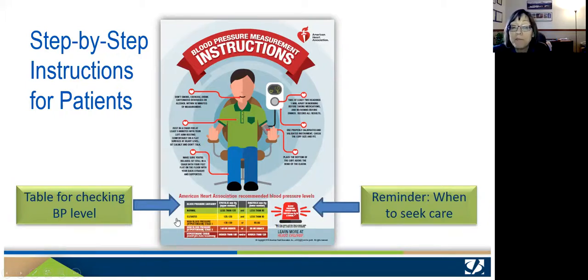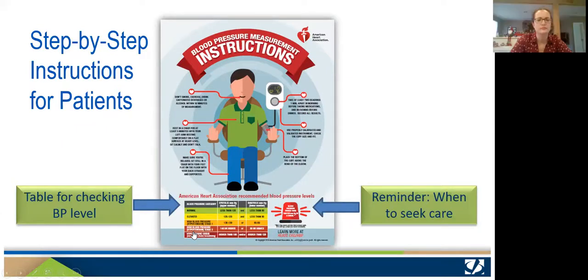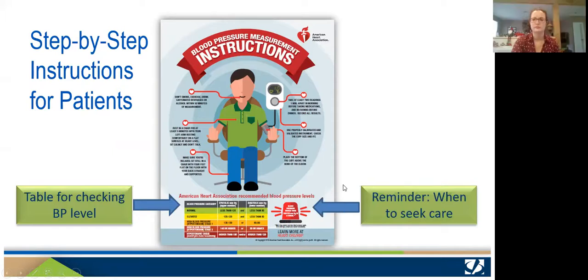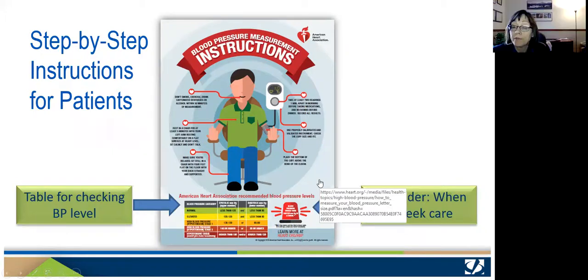Also down here at the bottom, you can see there's a table for checking your blood pressure level when you get your reading. And you'll be able to look at it and see what category it falls into, normal, elevated, and so on. And it has this reminder of when to seek care, just like we had written on the other piece of paper. It would be really important for you to know when you needed to call. Okay, so you're going to keep Mr. BP here handy while we go through this. Questions before we jump in?